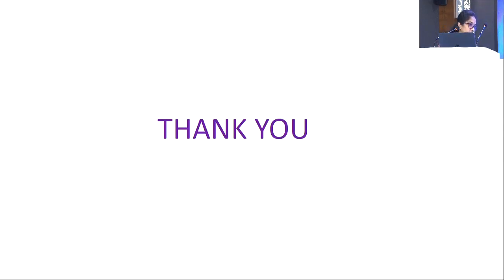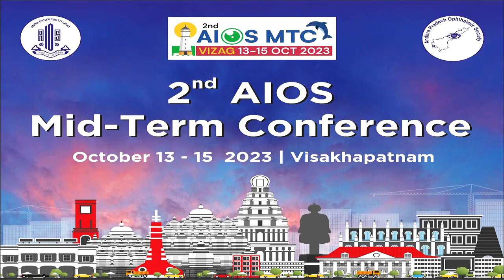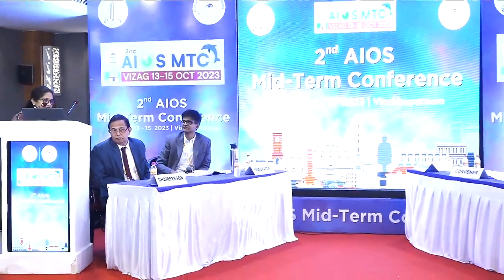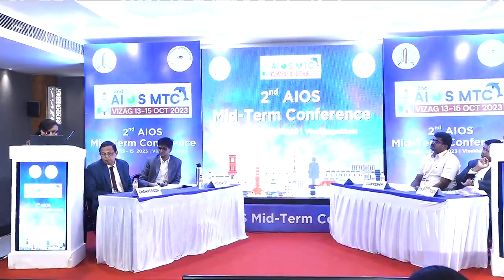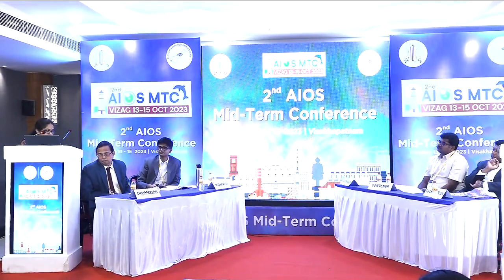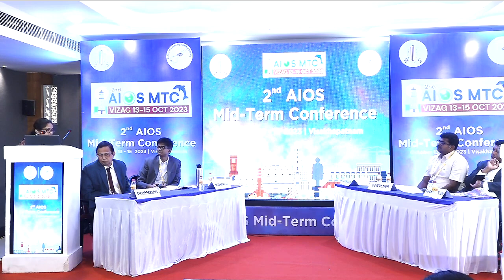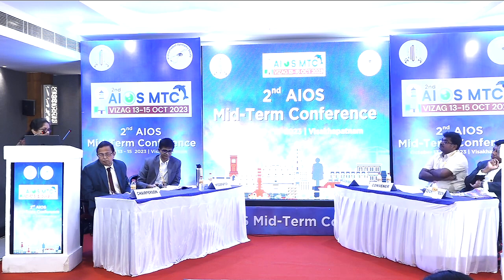Well documented case, but what is your take home message of the second case? So in that case, actually we had to monitor the RNFL thickness, and while monitoring the RNFL thickness in the second visit when she came, her RNFL thickness was decreasing, and immediately we saw that there are signs of optic atrophy. So we could have saved her eye if she had gone for shunt procedure in time.